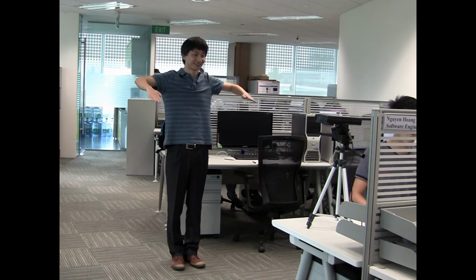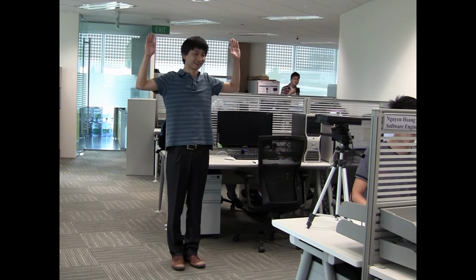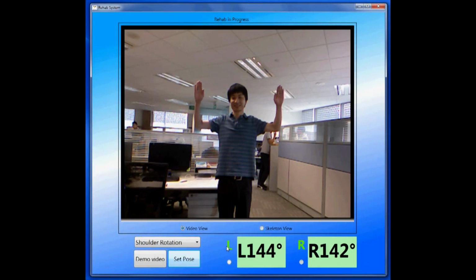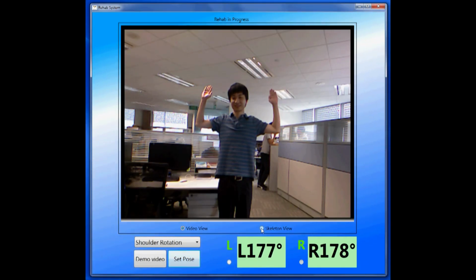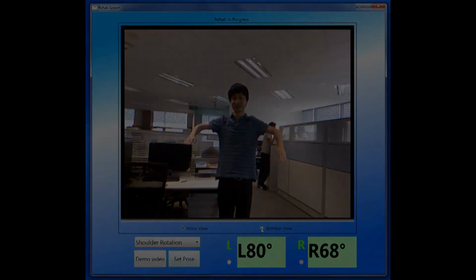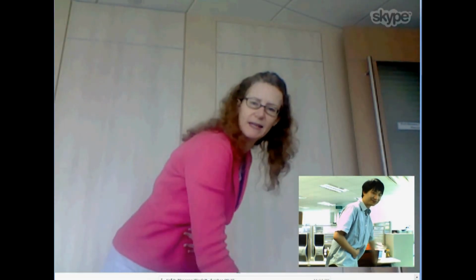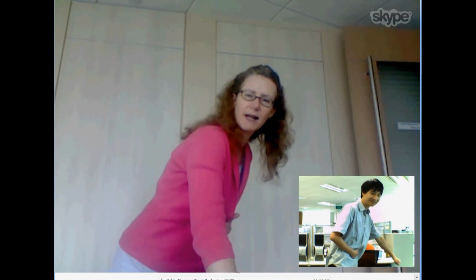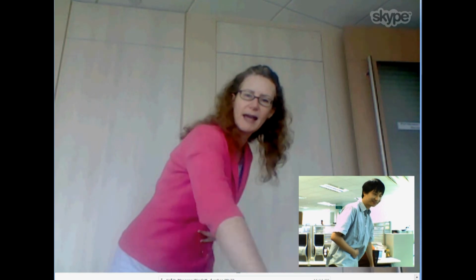The assistant will send a summary of the completed exercise session to the physical therapist so that the therapist knows how the patient is progressing. Video clips from troublesome parts of the session could also be sent to the therapist. If needed, the patient and therapist could use the Internet's free video chat facilities during a session to allow each of them to see each other without a trip to the clinic, which can be very difficult for patients with limited mobility.